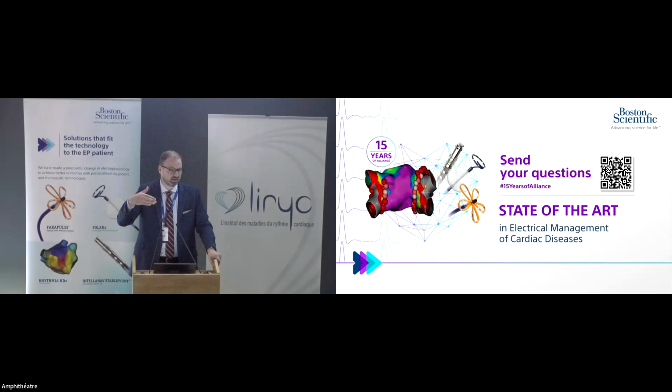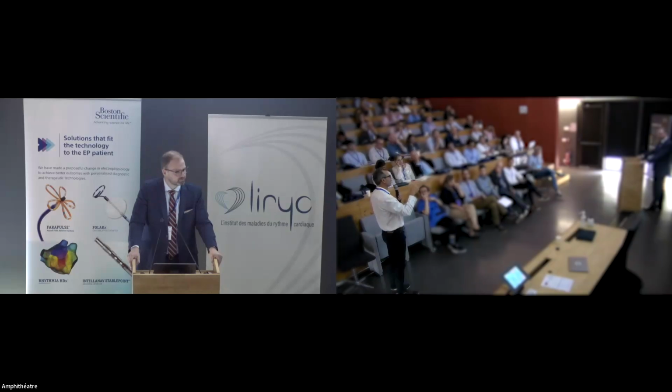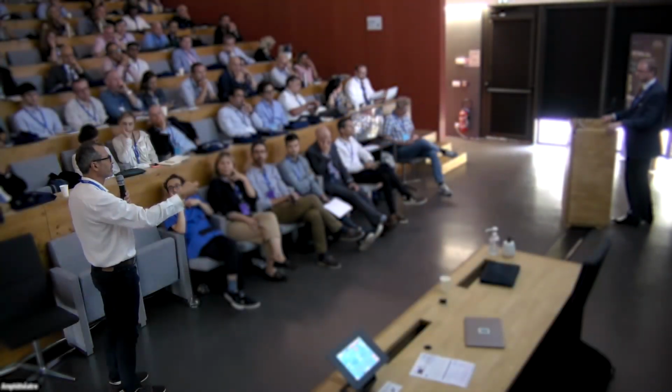be very shallow. And if you didn't match the waveform to the form factor of your catheter and take into account some of the dynamics of the biophysics, really just electromagnetics of what's going on there. That's probably the most I can say there, but the answer is absolutely different for a different catheter. But it's probably true to say that for a focal catheter that looks like the RF catheters we are using, it's better in unipolar as compared to bipolar, because with bipolar you have very little control on whether you're going to lie perpendicular or parallel, and it would be very different.